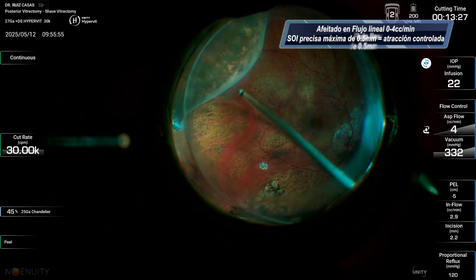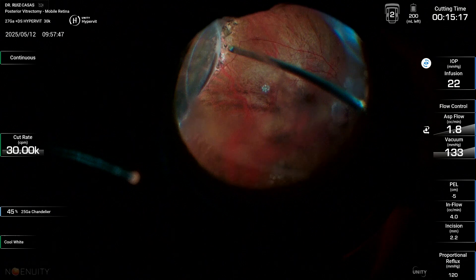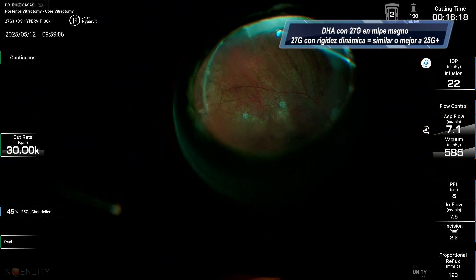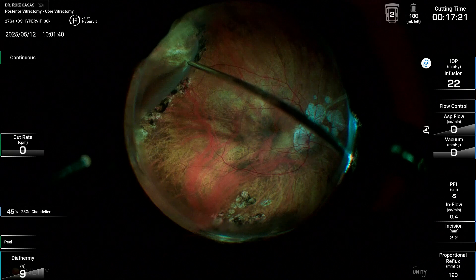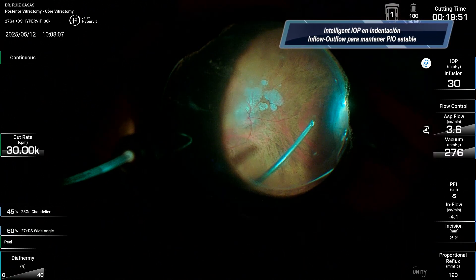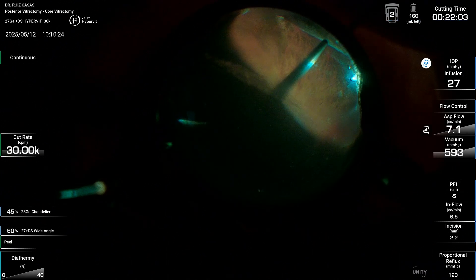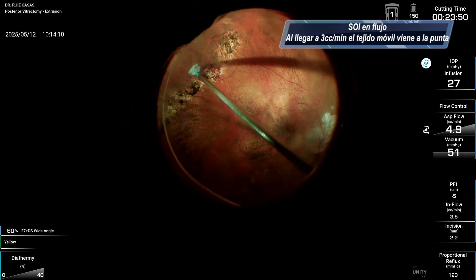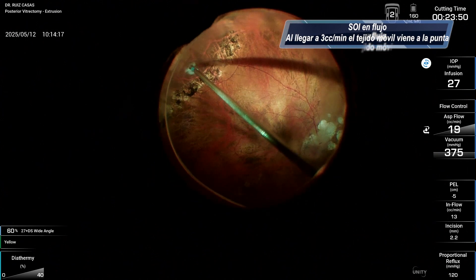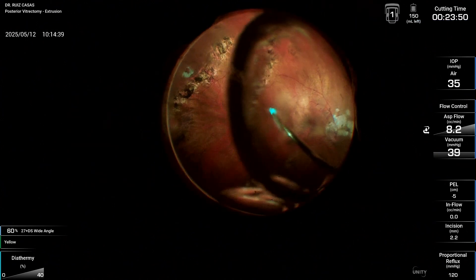You can see how nicely I can perform the peripheral vitrectomy, saving it with very little traction to the peripheral retina. Also in this case there was a localized retinal detachment, and as you can see, you can have perfect control of the sphere of influence and avoid any retinal trauma.